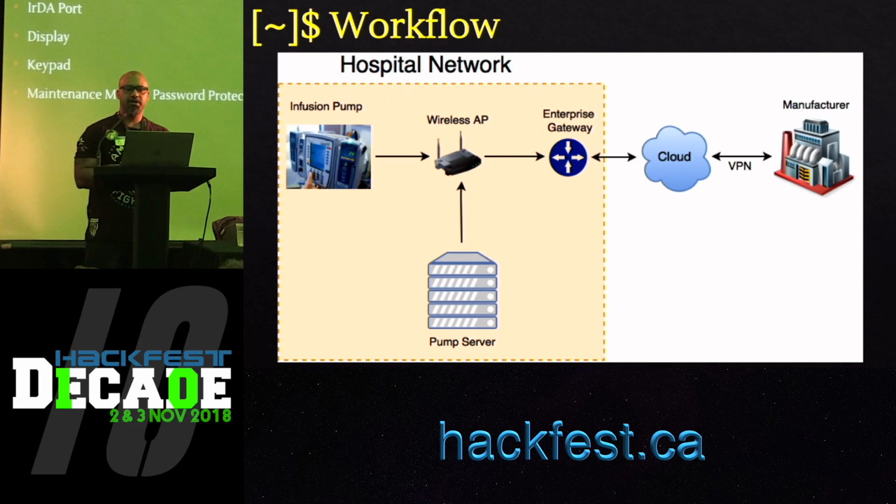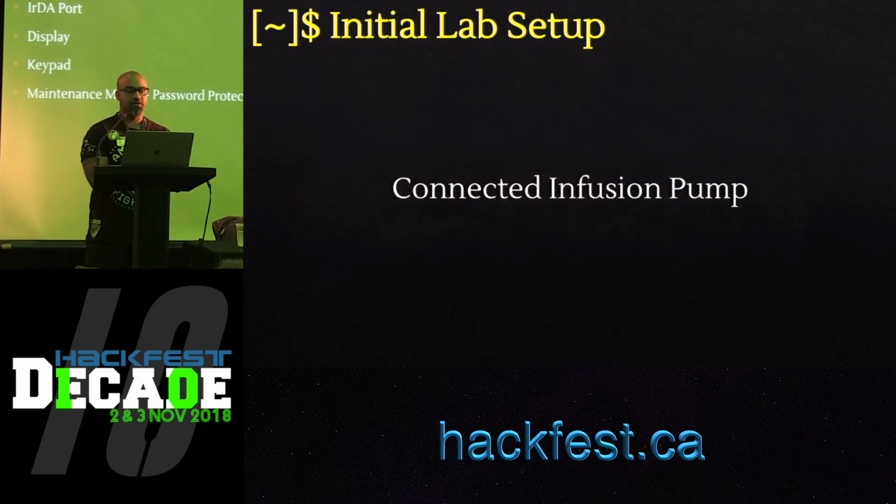It had the capability to connect over wireless, 802.11. It had proprietary power connectors. It also exposed an IRDA port. There was a display and a keypad. And there was a maintenance mode.